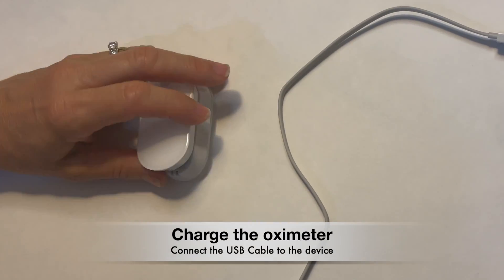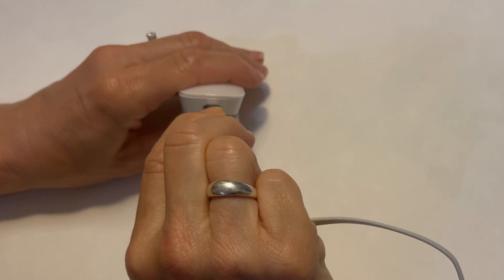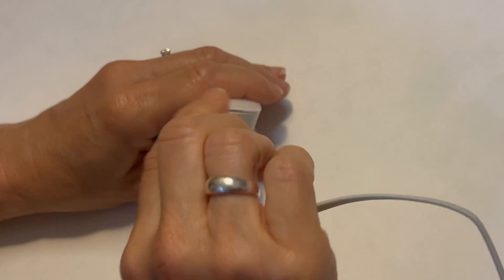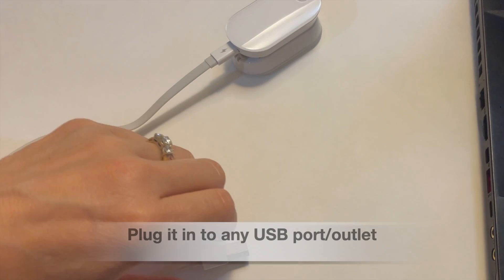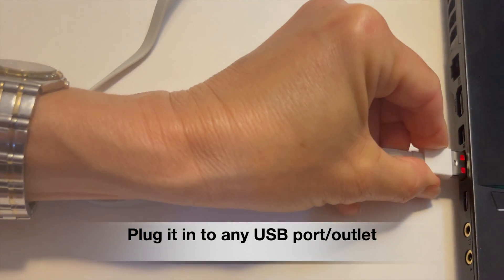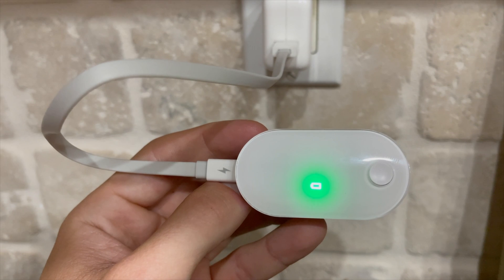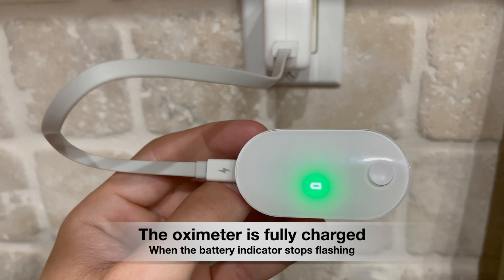After unboxing, charge the device by connecting the USB cable, as shown. Then plug the USB cable into any USB port or outlet, such as your computer, or into the included charging box into the wall outlet. Once the battery indicator on the device stops blinking, you'll know the device is fully charged.